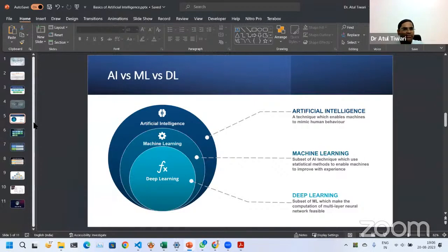We won't go into the detail of deep learning, but those who are really interested in learning AI in terms of pathology, specifically I'm talking about, deep learning is the real part which you will eventually have to learn, because as a pathologist in day-to-day life, we deal with microscopic slides. Microscopic slides are images. So statistical data are quite limited with respect to pathology, but slides are infinite.